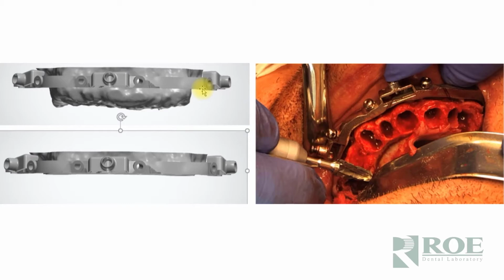So here's just an example of what we do. So the fixation base is the leveling plane. And use whatever tool. This is a very aggressive burr, but doctors use rongeurs, piezo, surgical saws. Level it down until you see the bone is reduced to this plane. And with a gloved finger, you can transition your finger from the metal to the bone, back and forth, just to make sure there's a smooth transition, and that there's no lip or catch or sharp edges.